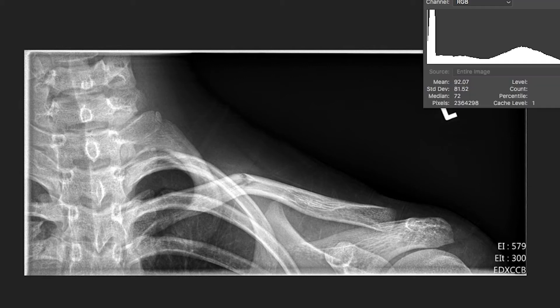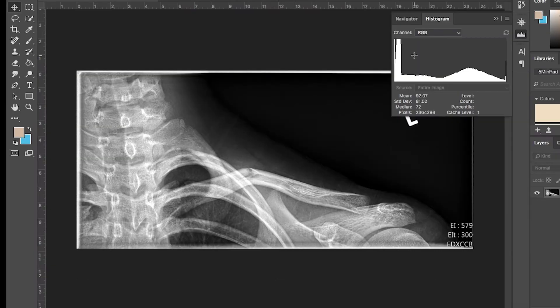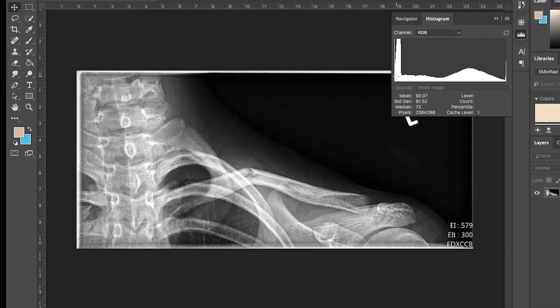Here in Photoshop, we can look at a histogram. I should point out one main difference between photographs and radiography: the histogram that comes up in Photoshop is different than the histograms we see in radiography. For the main reason being this high peak on the left — this represents the dark pixels. And then as you go right on the histogram, that represents the white areas. This little spike here is probably the white area surrounding the collimated field — it's absolutely white. This is a very large peak, pretty wide, for dark pixels.